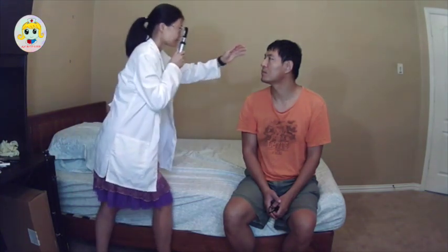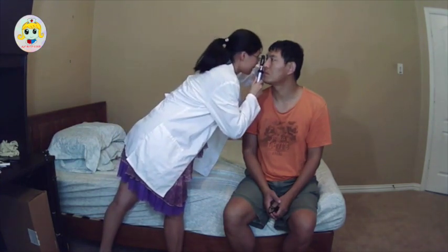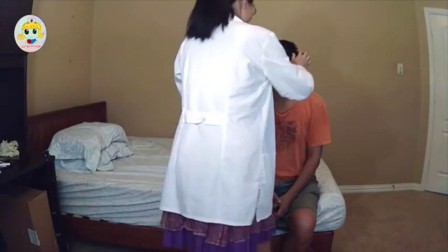Just stare at this scope. Okay, red reflex noted. Then I will move close to your face, very close to your face. Okay. We'll brace your head, and okay. Then I will observe the other eye.